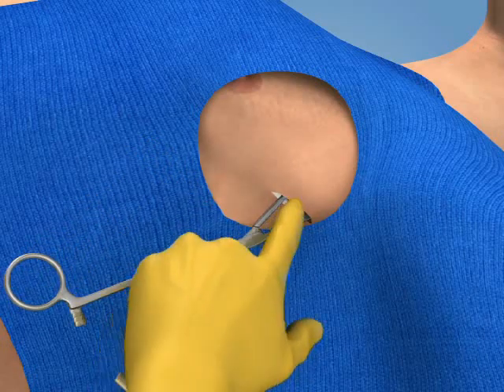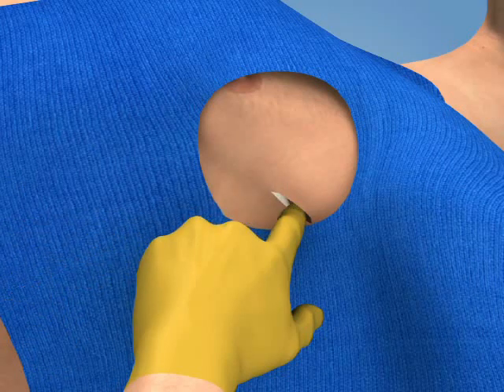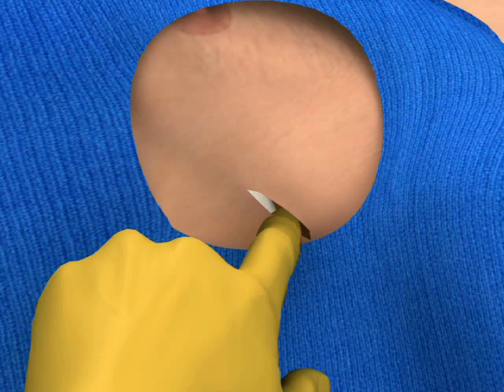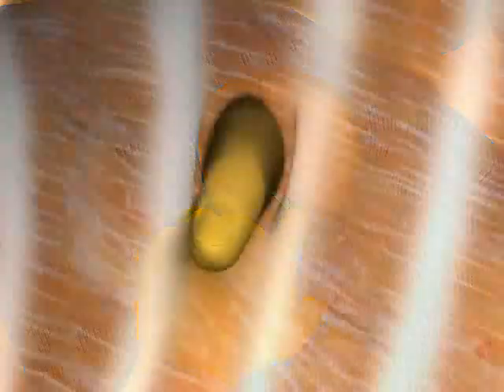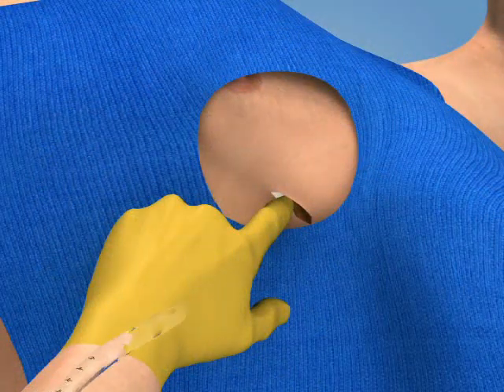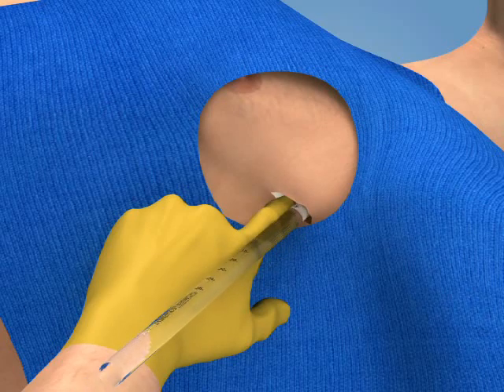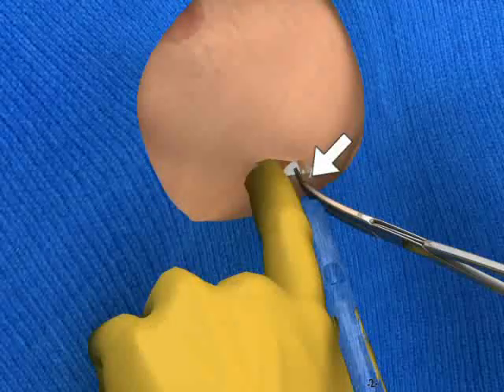Slide your finger over the clamp and into the pleural space and then remove the clamp. Leave your finger in this position so that the tract is not lost prior to insertion of the chest tube. Use your fingertip to palpate the pleural cavity and confirm that no solid organs or adhesions are present. Pass the tube along your finger, over the rib, through the intercostal space and into the pleural cavity. If desired, you may hold the tube in a large Kelly clamp during insertion.